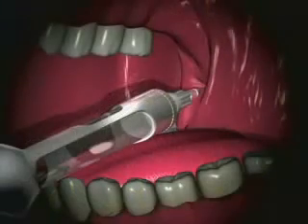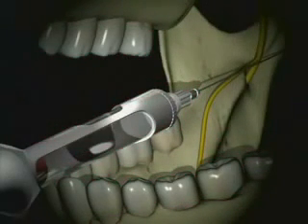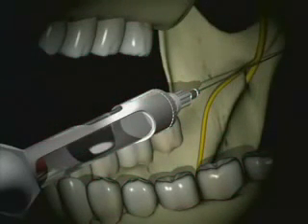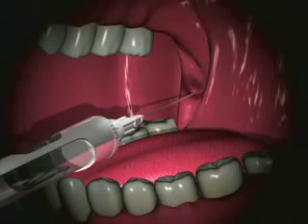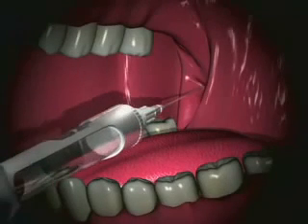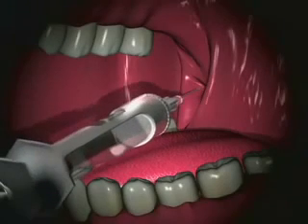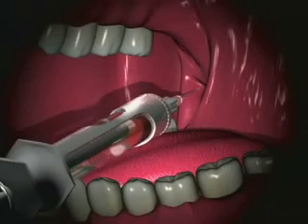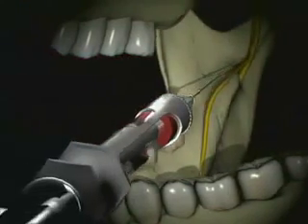If you do not contact bone after 25 millimeters and the needle is almost buried, you should redirect by withdrawing somewhat but not completely, and move the barrel of the syringe more laterally, advancing again until bone is contacted. You should repeat this procedure as necessary.